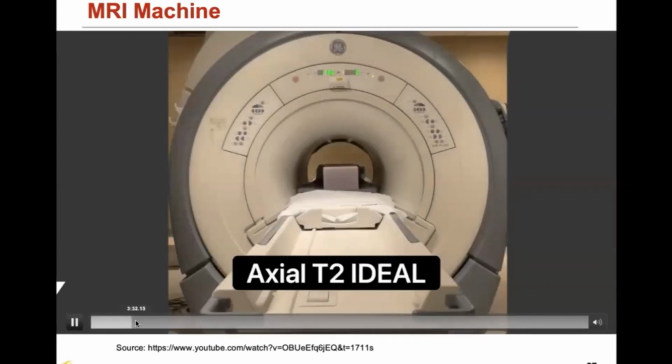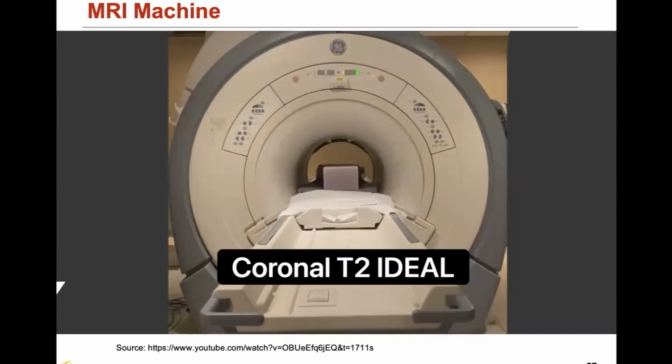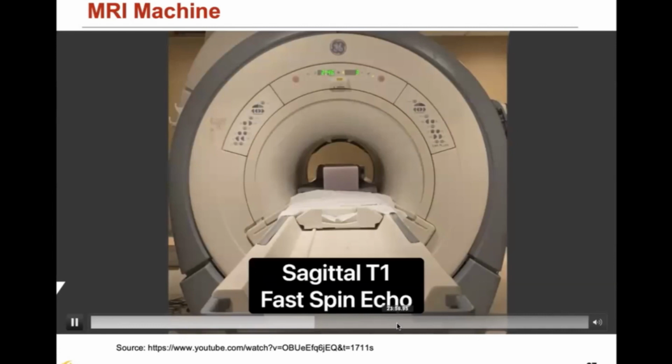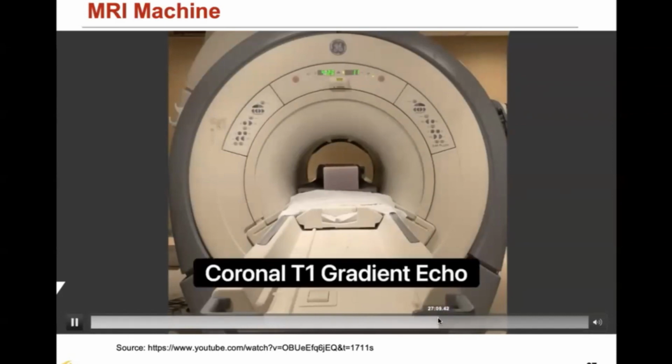Okay, then let's fast forward. So this is axial T2. Okay, this is a coronal T2. Axial T1. Sagittal T1. Okay. So you kind of get an idea, right?